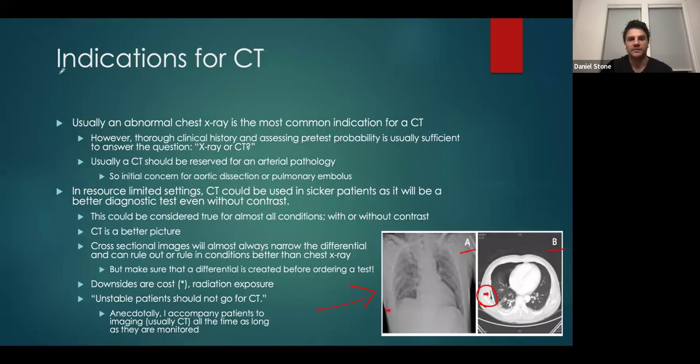So it's really important to remember that while a CT is indicated to evaluate for certain subtle pathologies, cross-sectional images are better. The downsides are cost, radiation exposure, but also the fact that there are increased incidental findings.